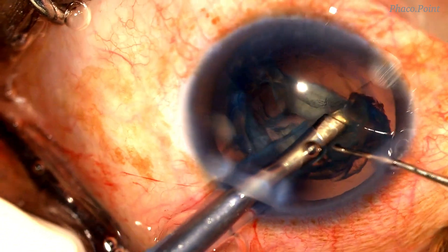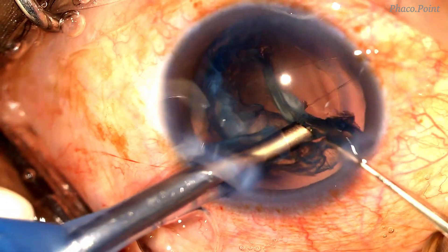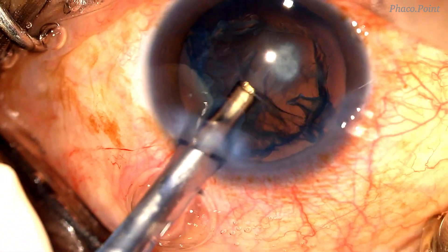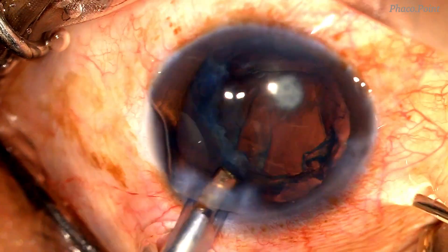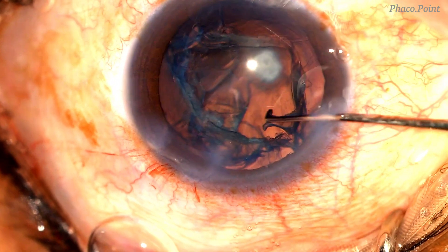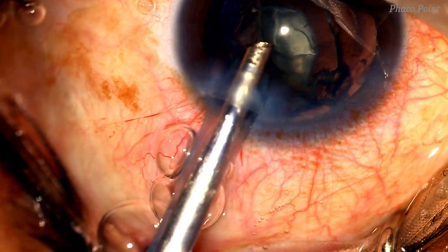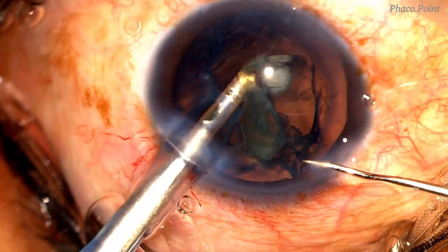With care and caution, I try to remove the epinucleus from all sides first prior to engaging the central part of the epinucleus. Failing to disengage the epinucleus any further, I remove my second instrument and perform a visco-fluid exchange prior to removing the phaco probe out of the eye. I now mechanically try to disengage the sub-incisional epinucleus. Having successfully disengaged it and brought it into the centre, I introduce the phaco probe and with extreme care and caution aspirate it.